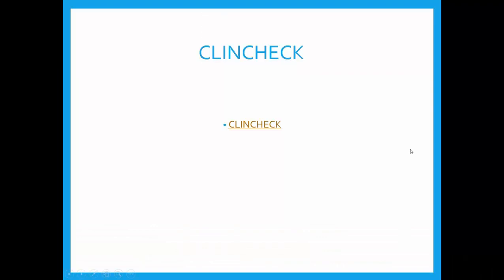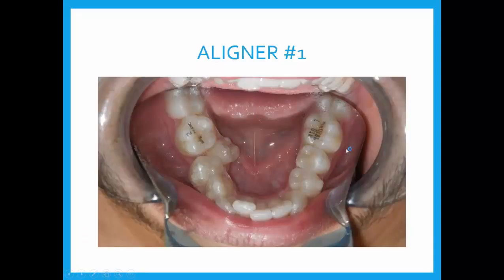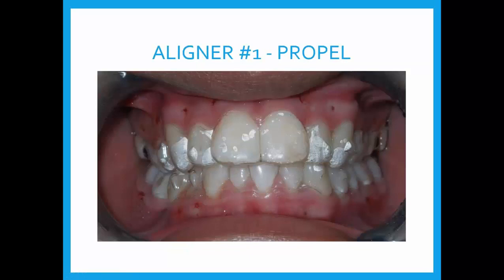We're going to watch that tooth follow along. This is the first aligner — all we had to do is teach him how to put it on. In a case like this, we don't use the traditional pattern of pushing the front on first — we go for that tooth first, bringing the aligner in and pushing under that tooth then dragging it over the buccal. Once we teach him to put it on, we're in great shape. Then here comes the Propel — we're going to do at least 12, and this was about 15 perforations per arch at the first round. The aligner fit is looking good. He's going to take his two Tylenol and we move along.